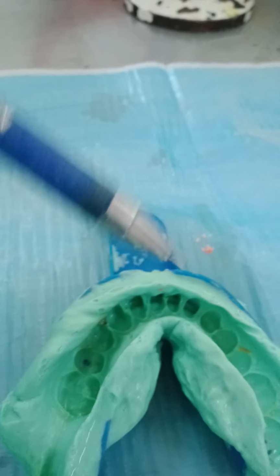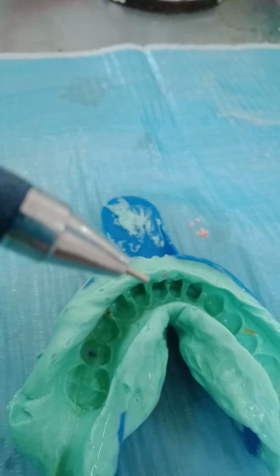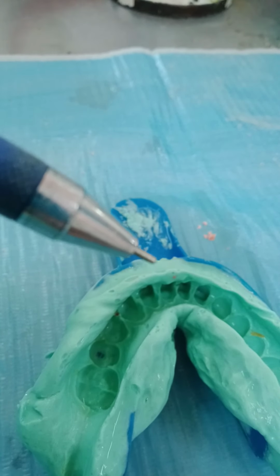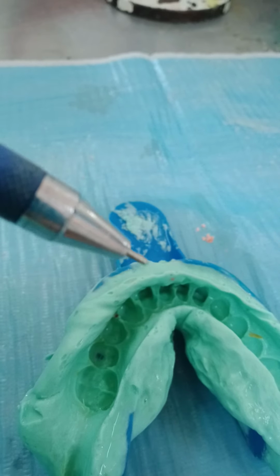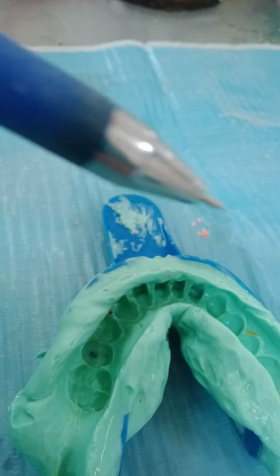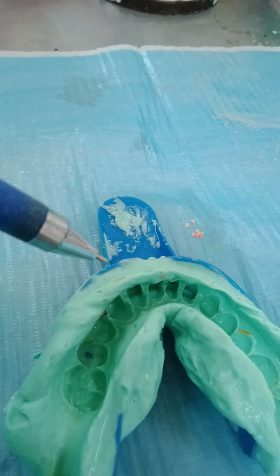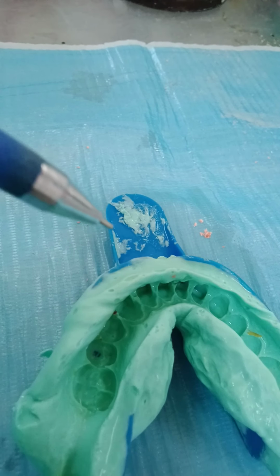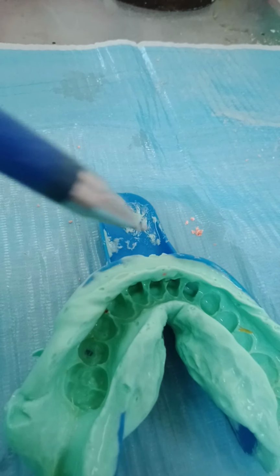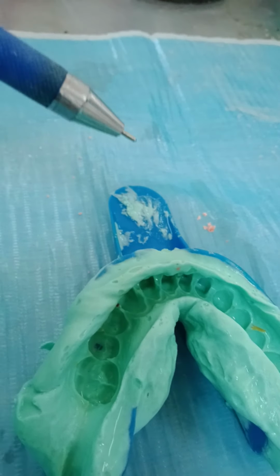How do I get a good labial sulcus on both the upper and lower? Simply, first of all, I move my tray away from the anterior teeth by 1 centimeter, for example, before seating vertically. Then, before pressing, I tell the patient, raise your tongue, and I stretch the lip, and then I begin pressing downwards. As I press, I come closer with the tray towards the teeth, but I have a sufficient amount of material to squeeze into the sulcus.